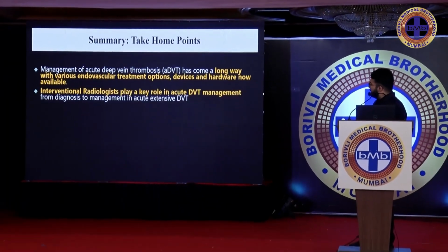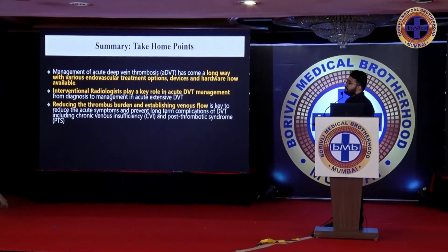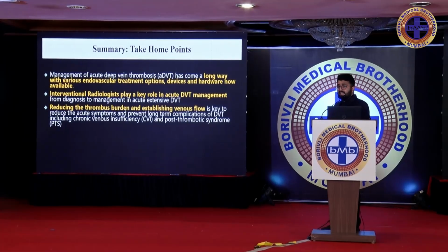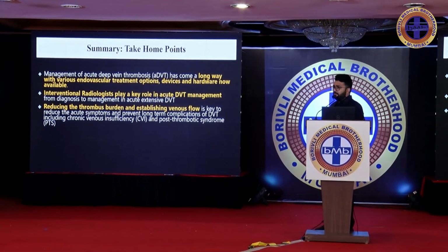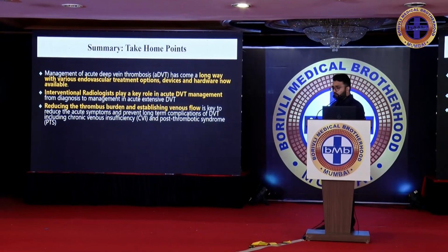And to summarize, acute DVT, we have come a long way in its management with various endovascular options that must be used when indicated. That is in acute proximal DVT involving the iliac vein with the IVC or iliofemoral DVT. IR plays a key role in acute DVT management and in reducing the thrombus burden in establishing the venous flow.